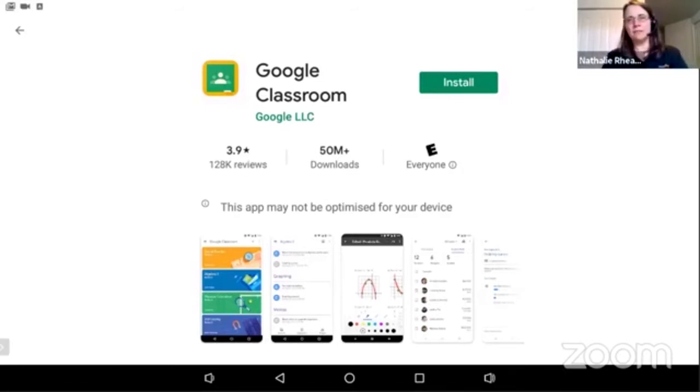Sometimes the cycle takes up to 5 days, so you may not have the message tomorrow, but if you want, you can go into your settings. I can show you how to do it. So let's go through how to update the tablet. That would be good. Yeah.